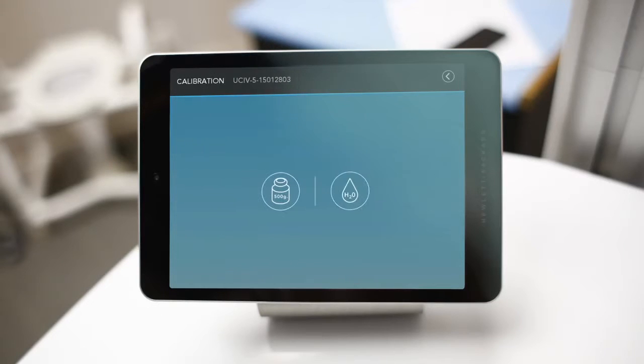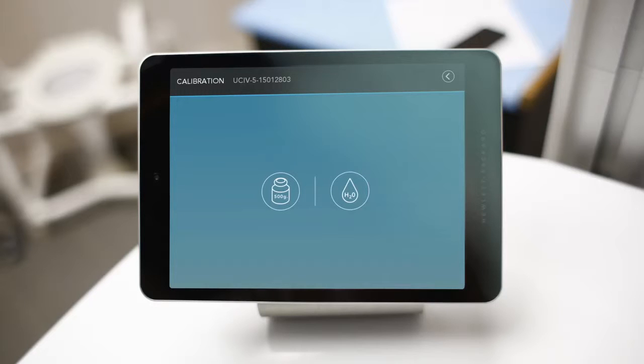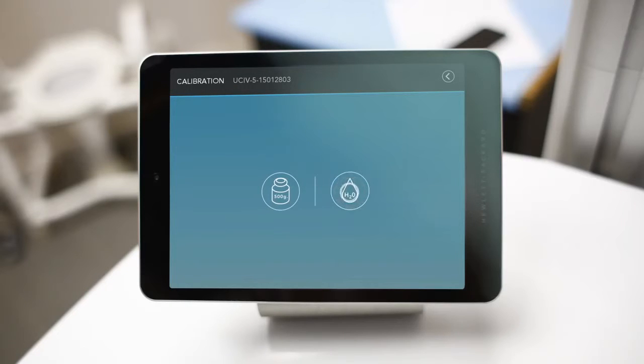You may either select the 500 gram weight or 500 milliliter of water calibration method. For this tutorial we will use 500 milliliters of water. Both methods will produce accurate results.